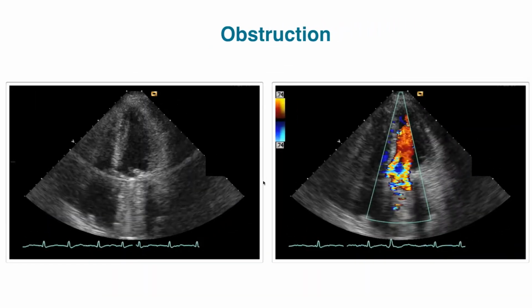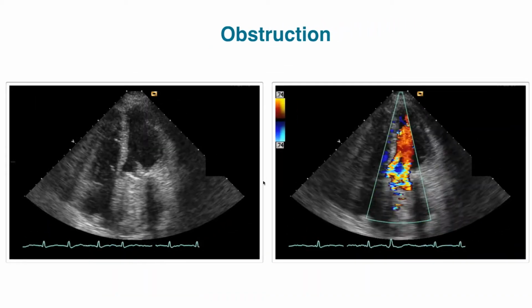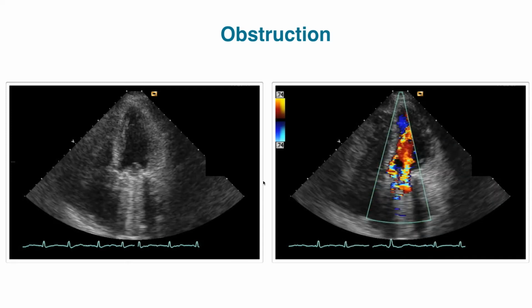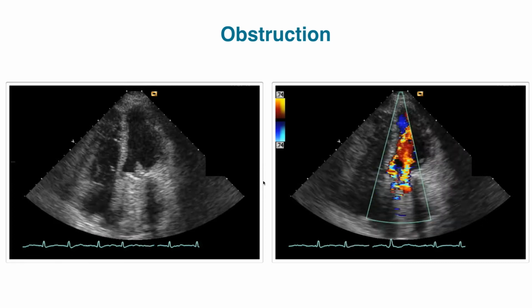Yes, for example, you sometimes have paravalvular leakages, or you might have fistulas and all sorts of things that are also important complications of endocarditis. Here you see a patient with obstruction due to the vegetation. Yes, you see that the patient has high velocities probably across the valve, but also that there is regurgitation.